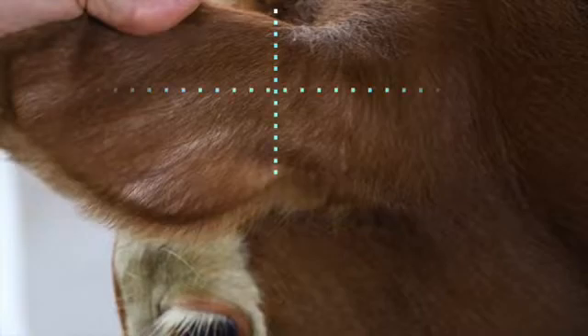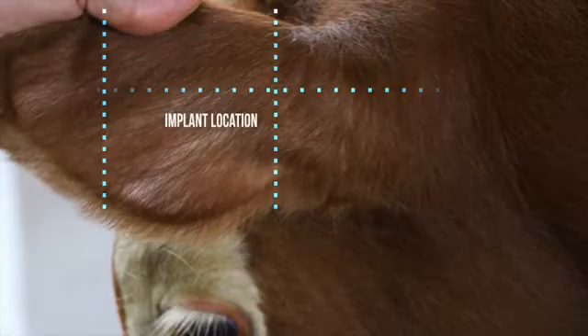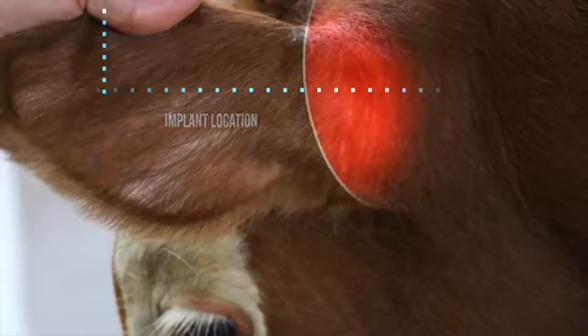Step 4. The implant site is subcutaneous between the skin and cartilage on the backside of the ear and below the midline of the ear. The implant must not be deposited closer to the head than the outer edge of the auricular cartilage ring.